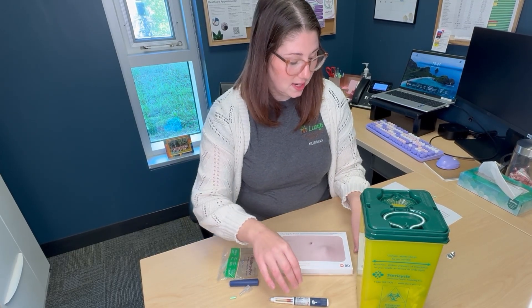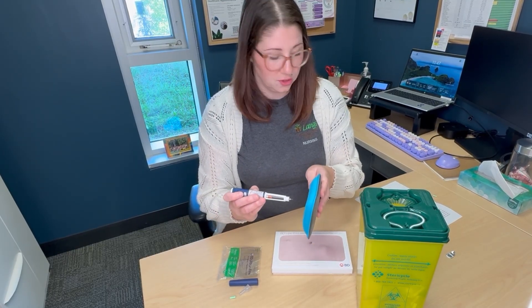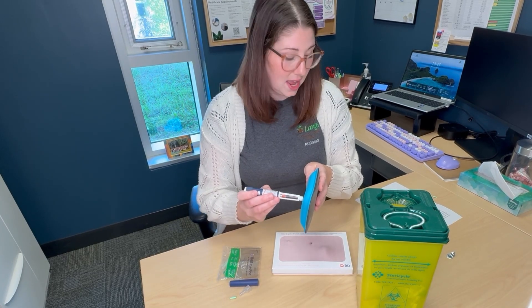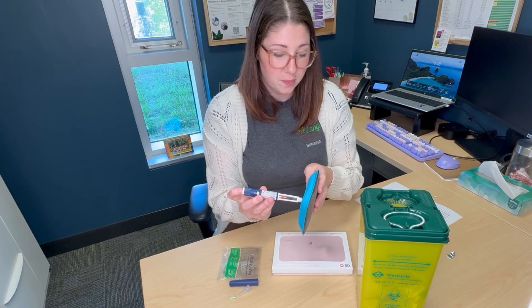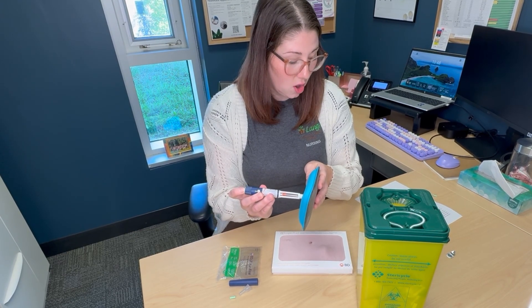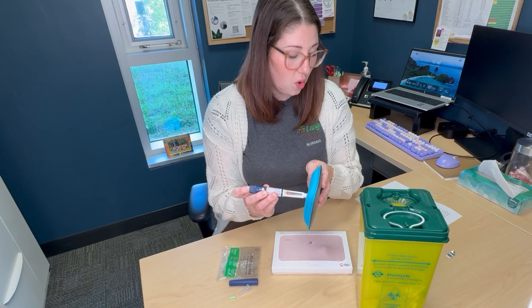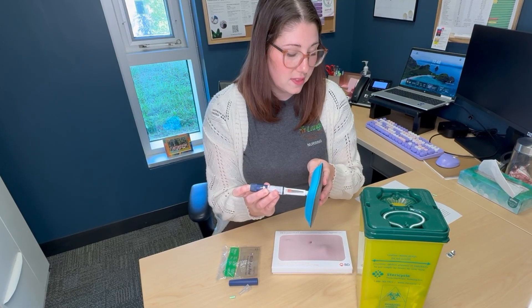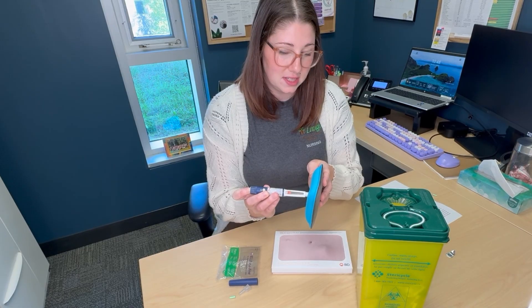Once you've selected your site, you will then inject the insulin at 90 degrees straight into the area — you do not need to angle the pen in any way. Press the injection button on the end of the pen all the way in to administer the insulin dose, and then hold it for 10 seconds before you remove the needle. This 10 seconds will allow the insulin to be absorbed into the tissue.